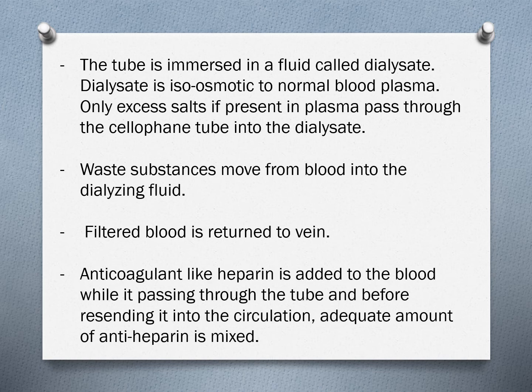Anticoagulant like heparin is added to the blood while it is passing through the tube, and before resending it into the circulation, an adequate amount of antiheparin is mixed. So heparin is an anticoagulant. It's a natural anticoagulant.